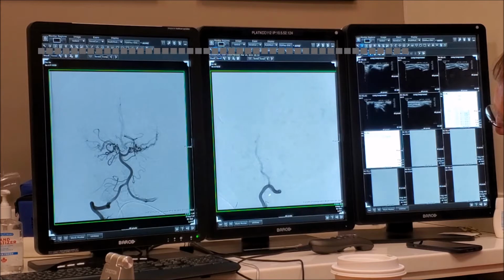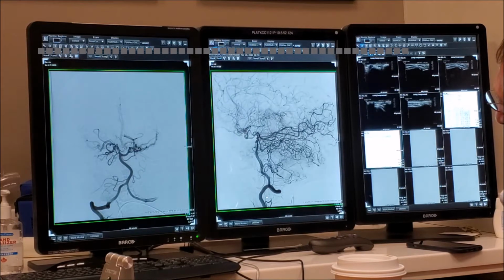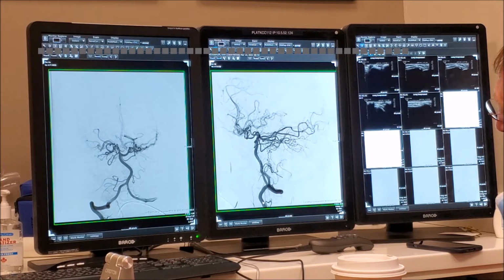Now if I had the bone here, here are the posterior elements, here are the anterior elements. This patient is behaving so well. General anesthesia, that's why. Okay, so it is the anterior spinal artery. It's a contribution that is going to anastomose. It's called the posterolateral, right? But this is anterior spinal. If it projects posterior to the vert, it is one. If it projects anterior to the vert, it is ascending pharyngeal. That's a good way to try to differentiate it.